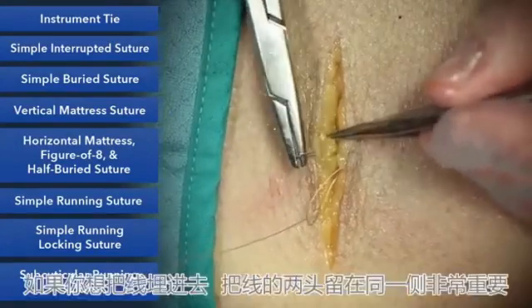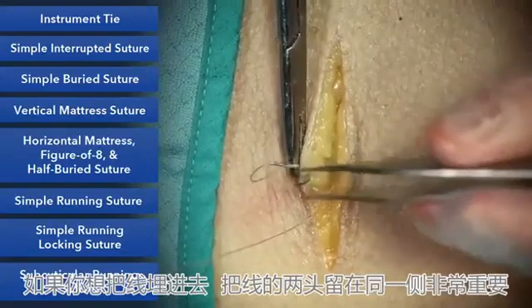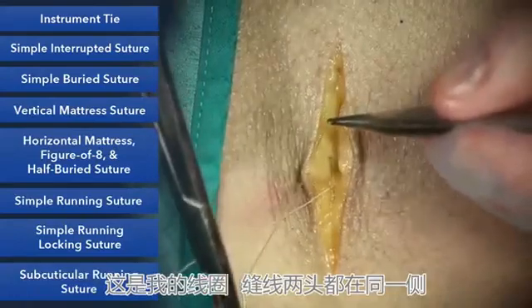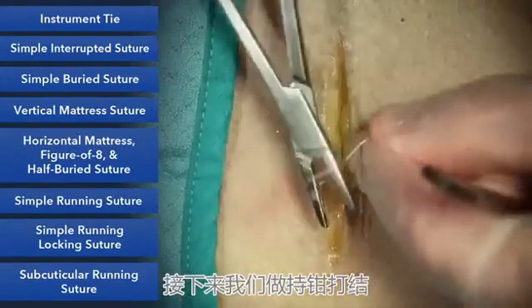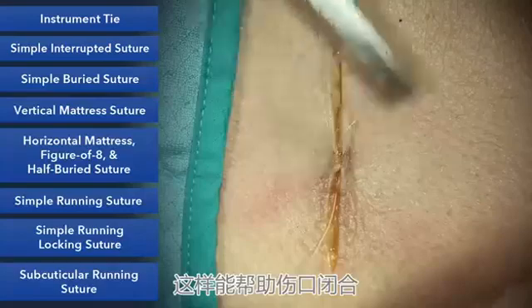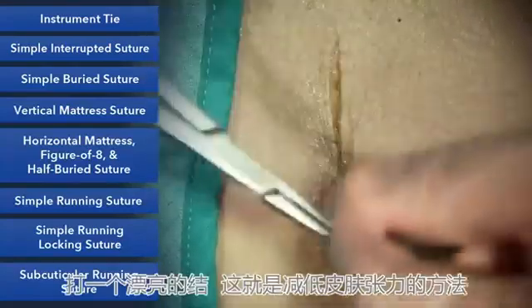And if you want your knot to bury, it's important that both ends are on the same side of the loop. And you see here's my loop, and here's the suture coming out from the same side. And as we tie this down, we'll do an instrument tie, but we'll pull it along the length of the wound, and that'll help the skin edges to come together. And we'll do a nice instrument tie.